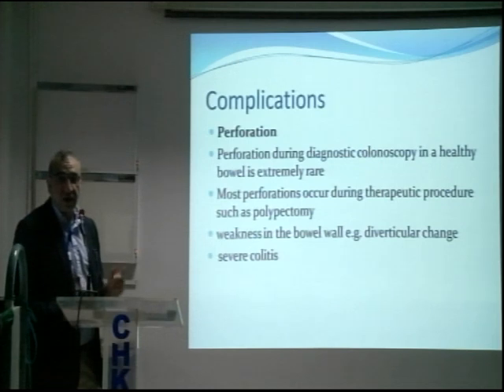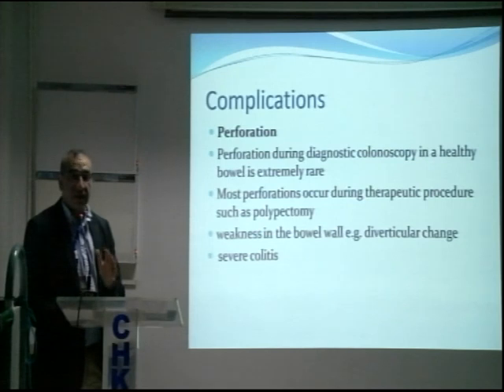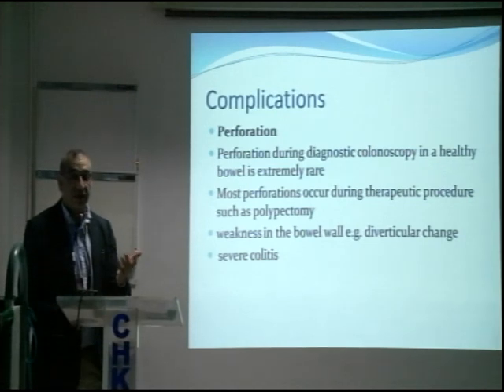As I mentioned, severe colitis, severe ulcerative colitis, is a risk for perforation. And if you are performing a colonoscopy and you find severe fulminant colitis in the patient, stop your colonoscopy. Do not proceed to the cecum, because you are putting them at risk of a perforation. So in severe fulminant colitis, it is perfectly acceptable to abort your colonoscopy, because all you need to do from that procedure is the diagnosis that the patient has colitis, and the degree of the colitis. Because the treatment is not going to be any different. If the patient has got severe ulcerative colitis, their treatment is intravenous steroids or rescue therapy, which can include biologics like infliximab or surgery.